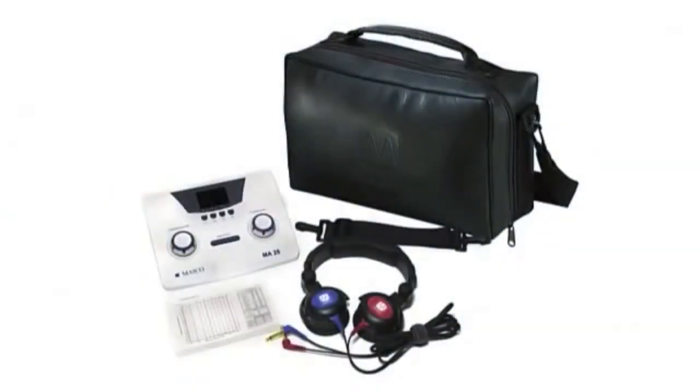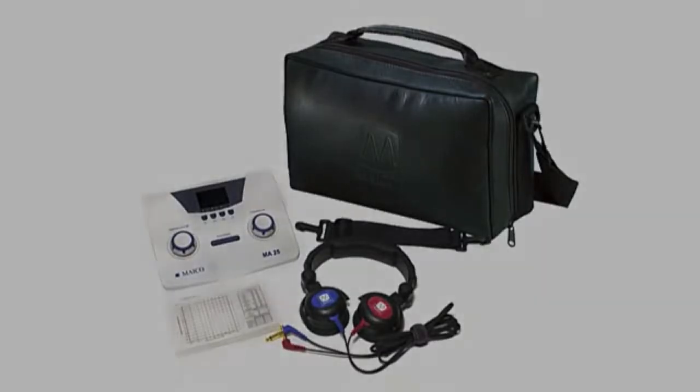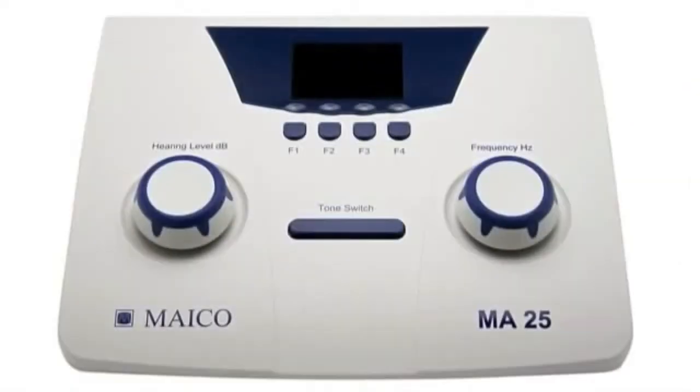This is an example of one way to conduct a typical hearing screening on a school-age child. Please note that each state and school district may have their own guidelines, and those specific guidelines should be followed when conducting a hearing screening at your own location.